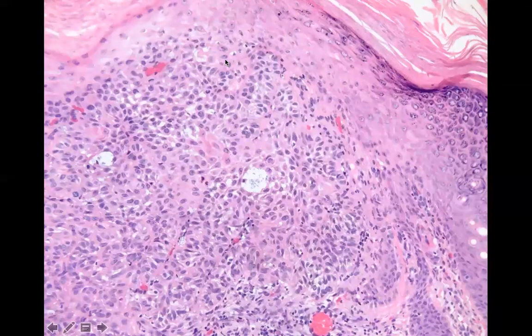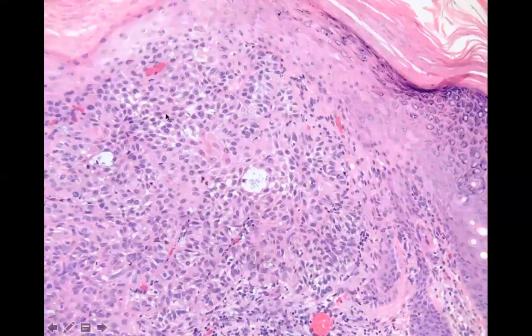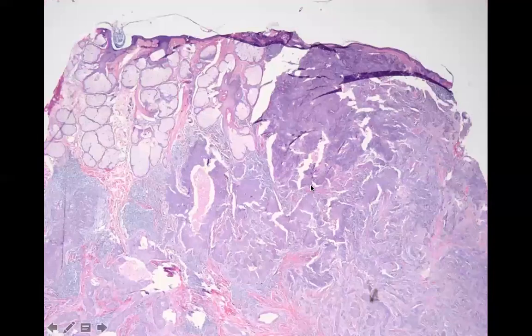Here's an up close view. See how you're not going through squamous cell carcinoma in situ before you're dropping down. And these are atypical keratinocytes, which you can tell because they're pink, they're making little keratin bits, and they have desmosomes for the most part holding them together. Now, that's a well-differentiated squamous cell carcinoma. You can easily tell these are keratinocytes.